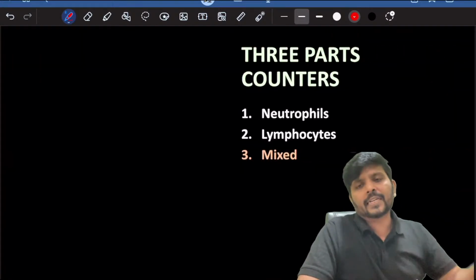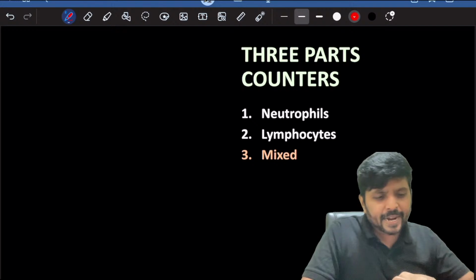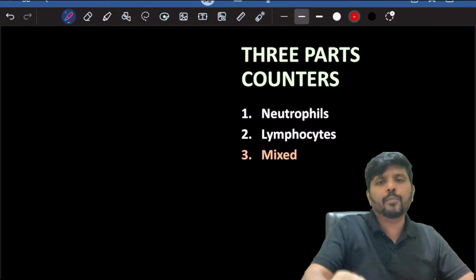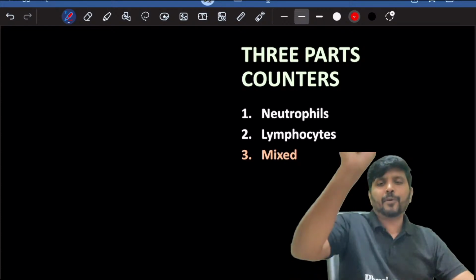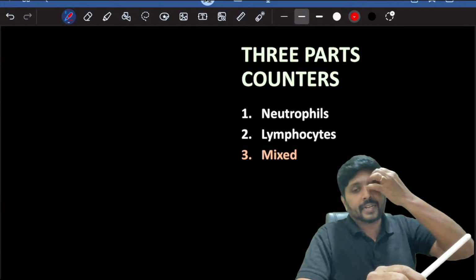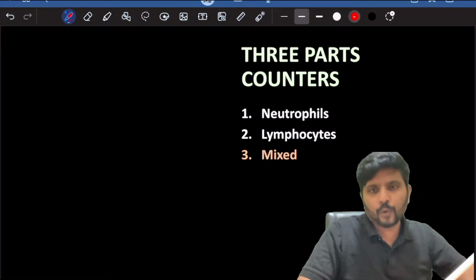Right. So let's come to that. What does it mean? An automated hemogram literally replaces your Neubauer chamber nowadays. It is a point of care test. So let me say, what are all the different types of Coulter counter?